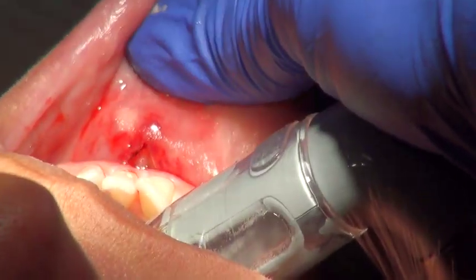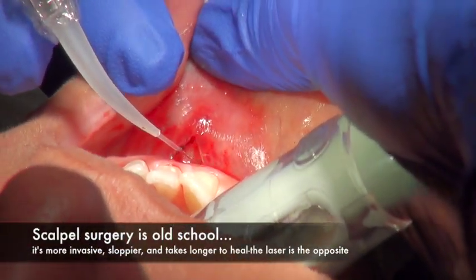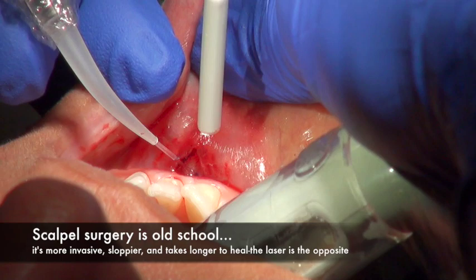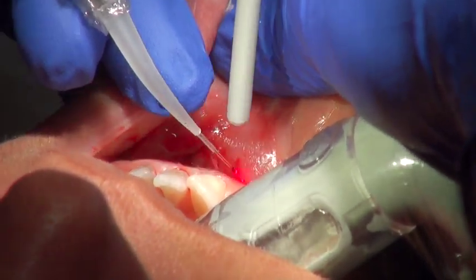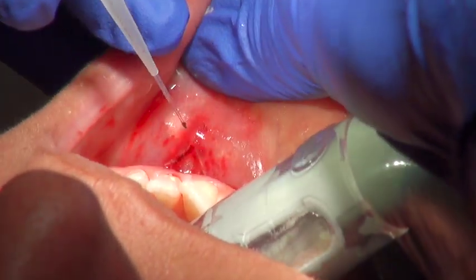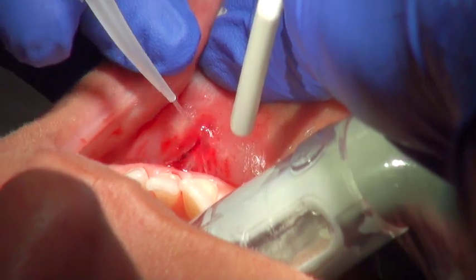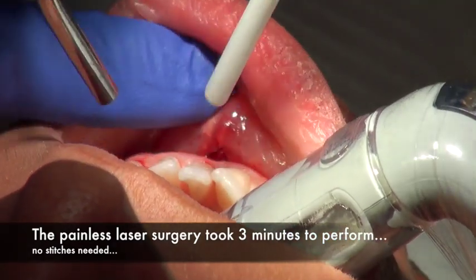What's it gonna feel like for her to heal? It's gonna be sore. It's not a big deal. Lasers are easy. Scalpel, that's kind of brutal. There. About done. So why cut it out? This thing is fairly... It is. I just never deal with it. Okay. You did that? Yep.